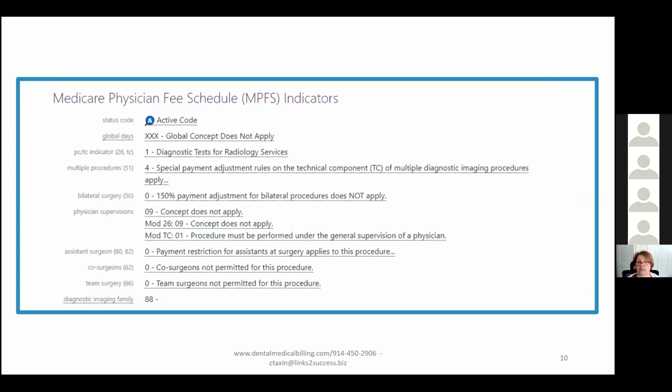And we should be taking the same type of CBCT scans for us to know that what we did looks good. And then at the end, is it healed and is everything good? So that when we dismiss the patient from our treatment plan, we are confident that we've addressed the issues in full. And they do pay for the bilateral procedures, but if you see, it does not apply to CBCT scan when you're taking the whole one.